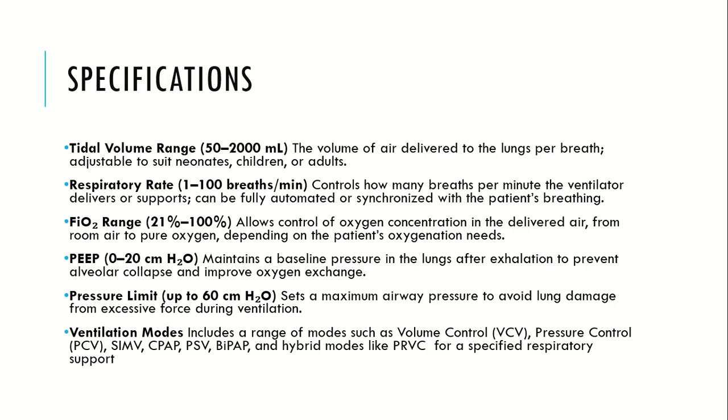So now we will talk about the specifications. The tidal volume ranges from 50 to 2000 ml, and the respiratory rate is from 1 to 100 breaths per minute, and the oxygen concentration ranges from 21% to 100%, and the PEEP is from 0 to 20 centimeters of H2O.